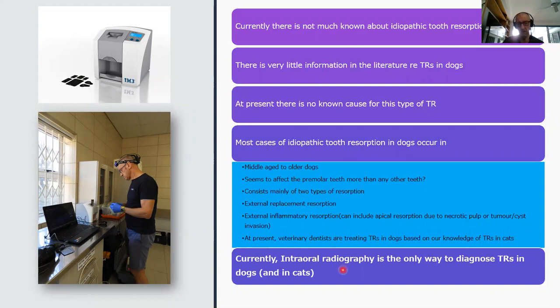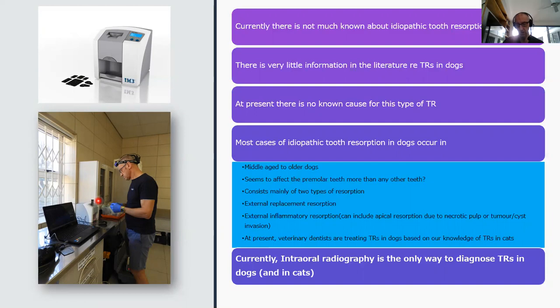Intraoral radiography is the only way to diagnose tooth resorptions in dogs and also in cats. You can see the image on the left here is a CR7 unit processing a radiograph. It is really imperative that we take intraoral radiography, especially when dealing with middle-aged to older animals.